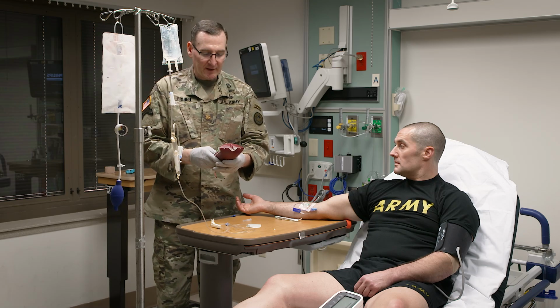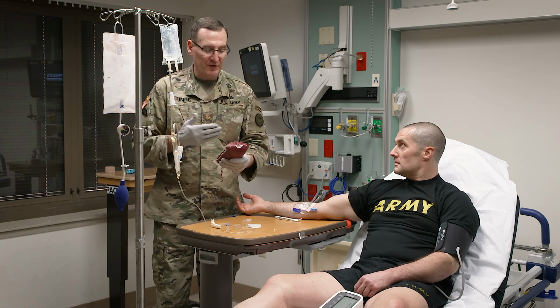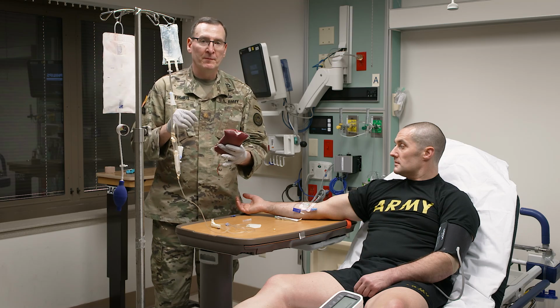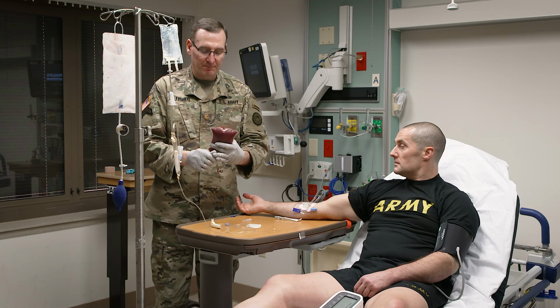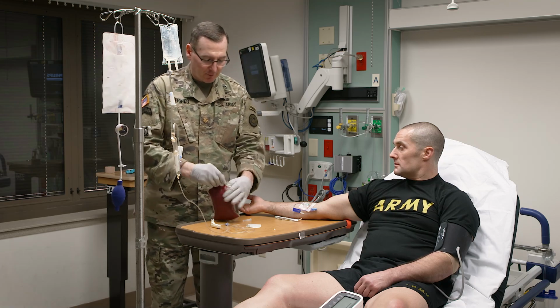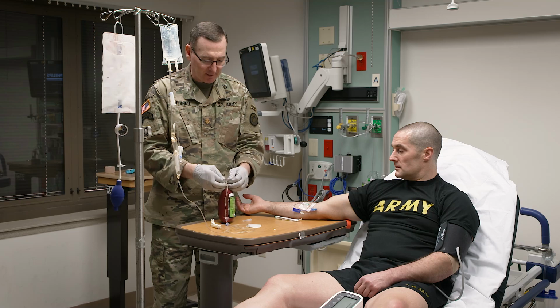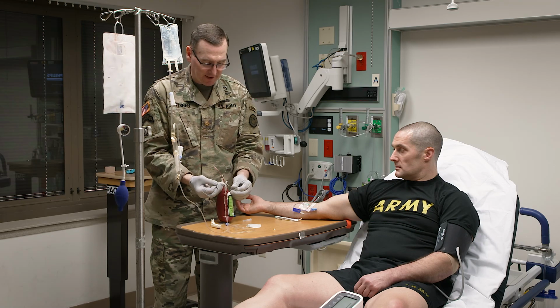Okay? Once I do that, if possible, I want to make sure someone else is there with me to confirm that this is the right patient, right blood type, and we're doing it for the right reasons. Okay? Given that's complete, we'll go ahead and get started. These blood bags peel back. They don't pull off, they peel back.